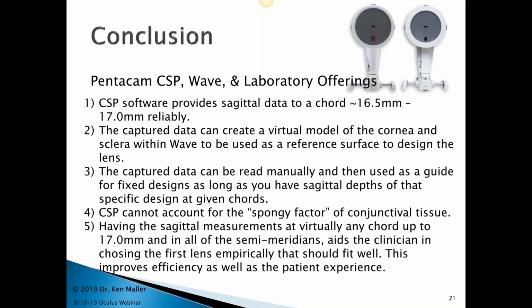And I would really like to see the patient be able to leave with the first lens. And it's really gotten to that stage now that in isolated cases, I'm actually starting to put trial lenses on, which I haven't done in at least 15 years, just so I can get power, so I have some idea of what I really need to put in terms of power onto that first empirically designed lens.